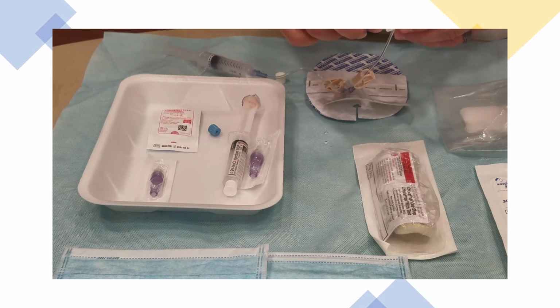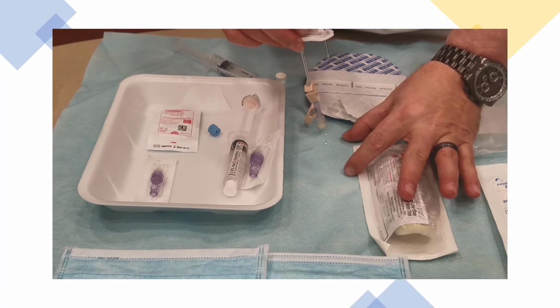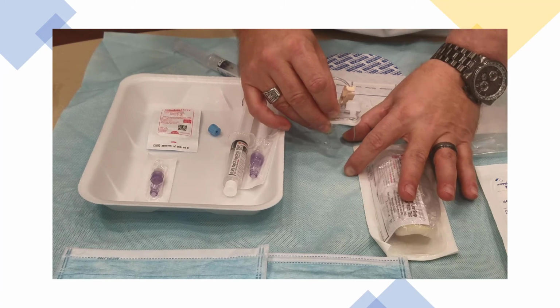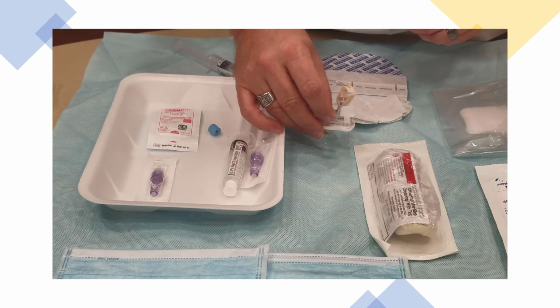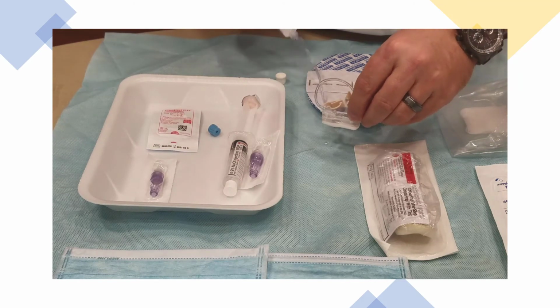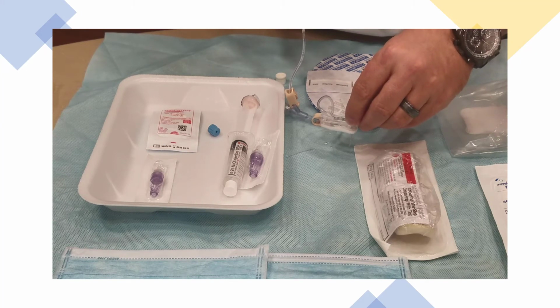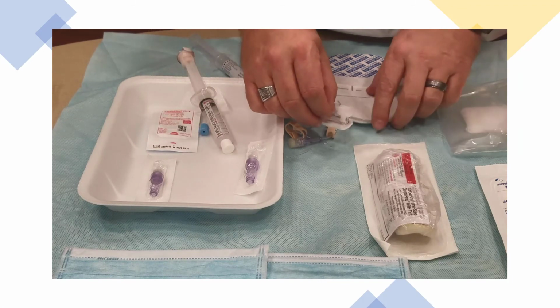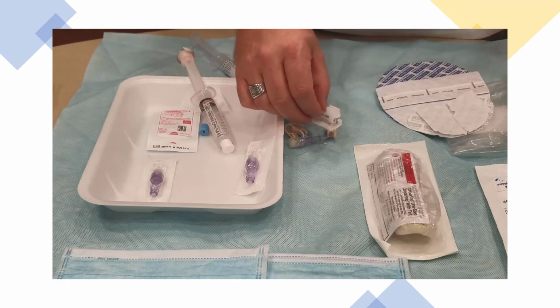You're going to access your site. Take off the cap, hold skin taut, 90-degree angle. You go down till you hit the back of the Cath. Once you get there, you're going to aspirate. As long as you have a blood return, you're good. Inject with a full 10 cc's and then flush again. Put your transparent dressing on along with the BioPatch first.